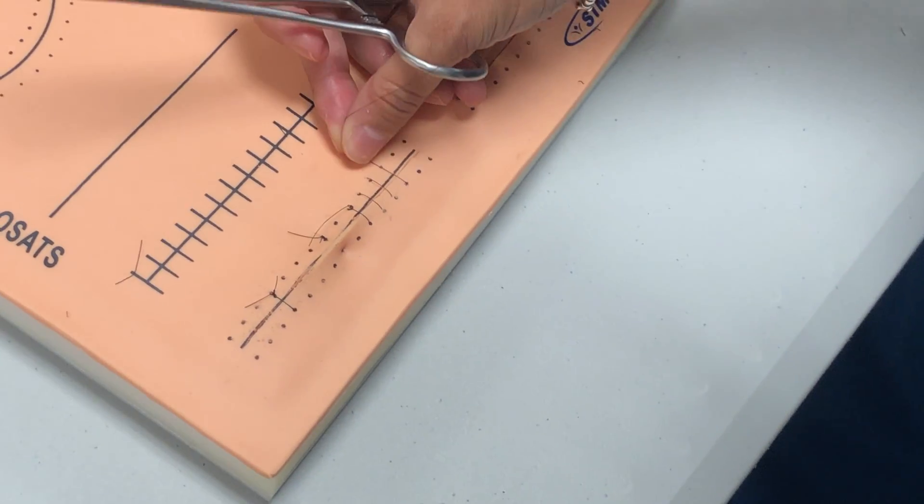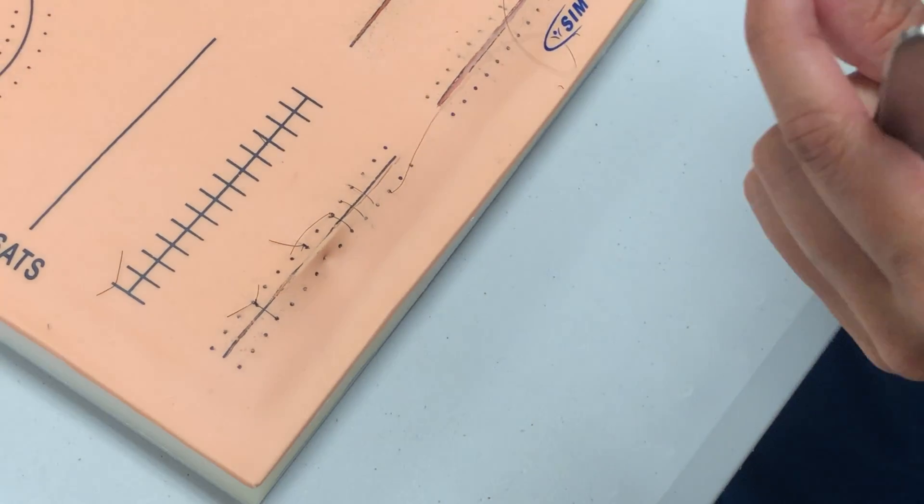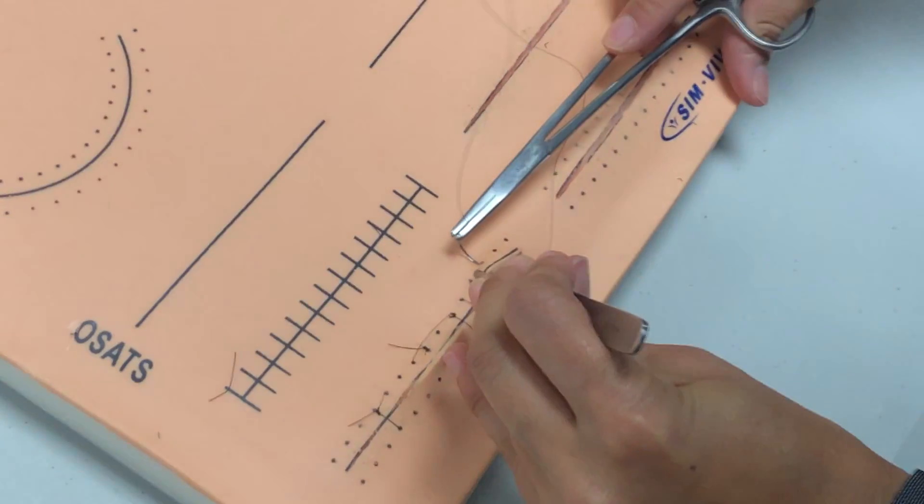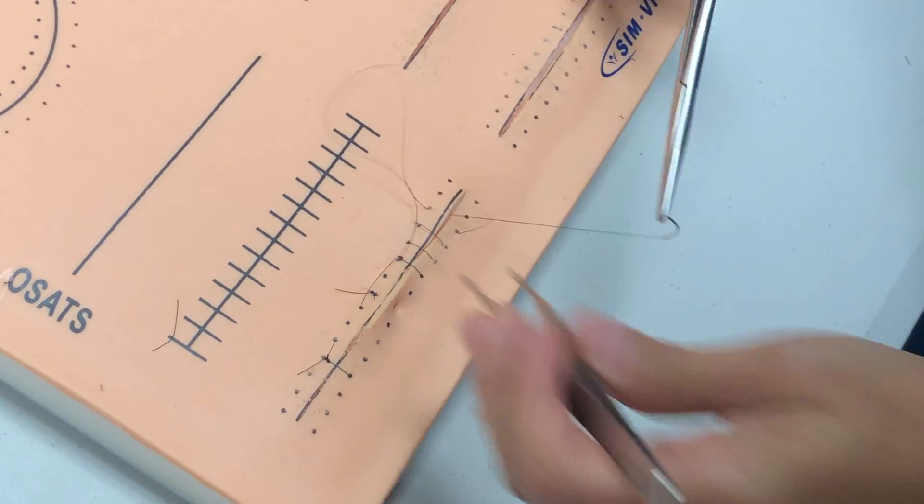So if I don't have the dot there, I'm going to kind of lay it across to see, okay, I know kind of ballpark where I'm going. So I'll come through here, finish that.